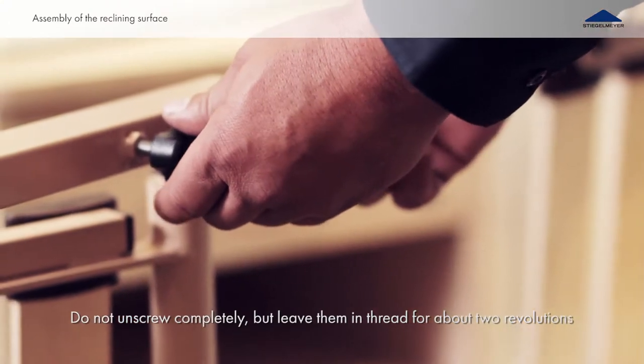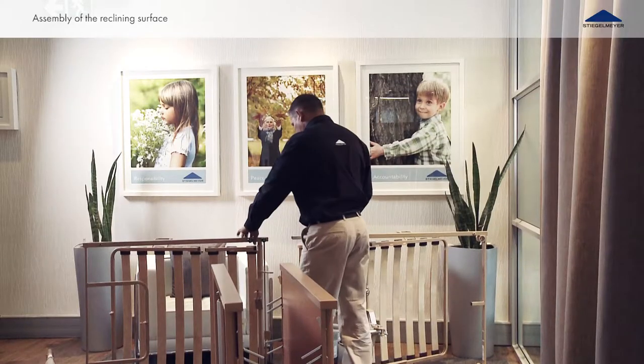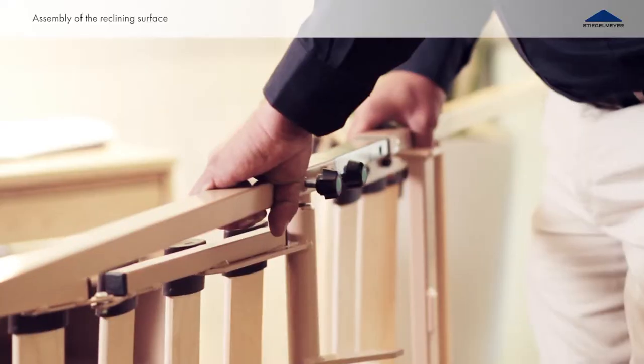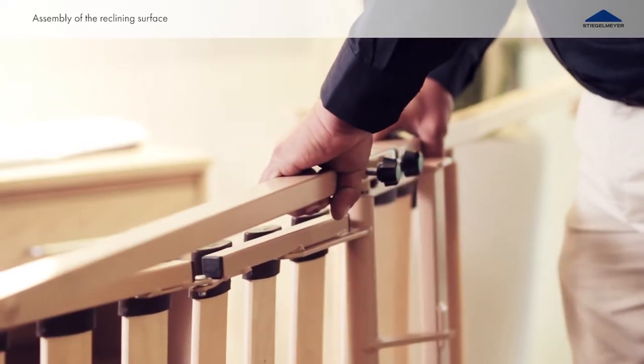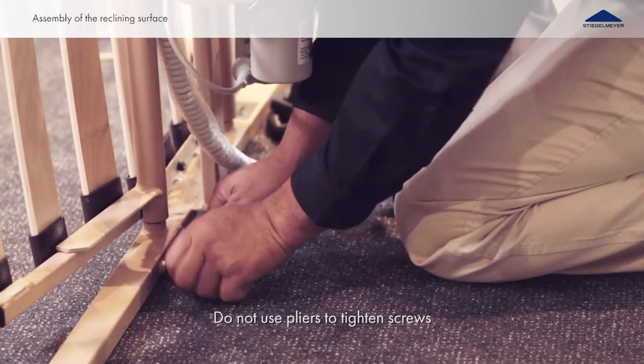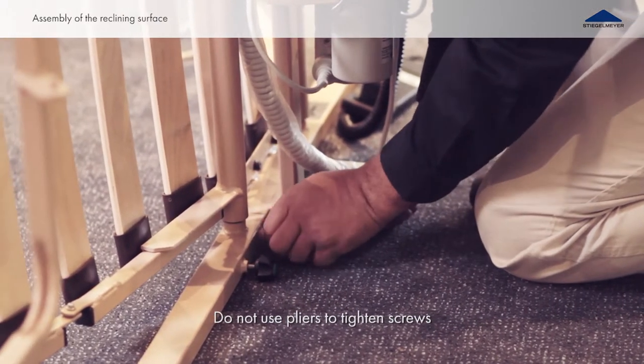Loosen the four knurled screws. Insert the halves of the reclining surface frame into each other. Tighten the four knurled screws, two on each side.